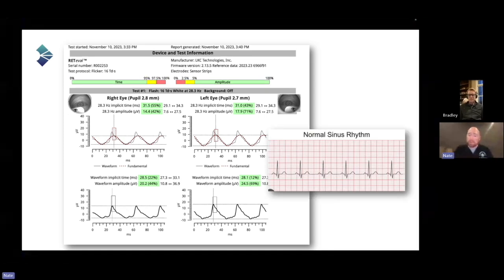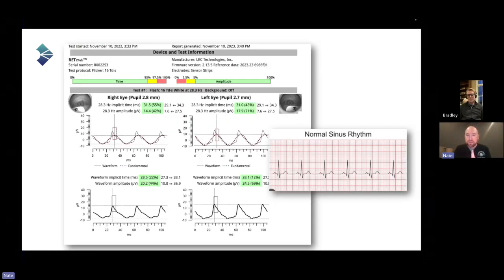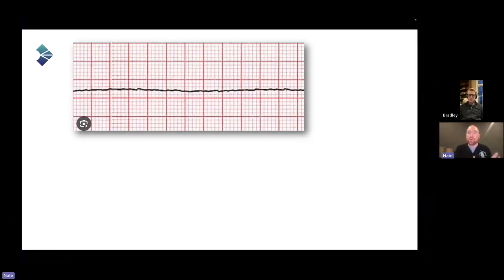But we can all probably look at this and say, that looks like a normal EKG. That looks pretty good because the speed and especially the strength are showing on what looks to be a fairly normal EKG. And even though none of us are cardiologists, I'm guessing all of us recognize that this is not a normal EKG, right? The speed and the strength are gone. Obviously, this is flatlined, an incredibly abnormal EKG. But notice the difference in the strength, which is the height of the peaks. There are no peaks here at all. So the strength is gone in this patient where the heart is not functioning at all.